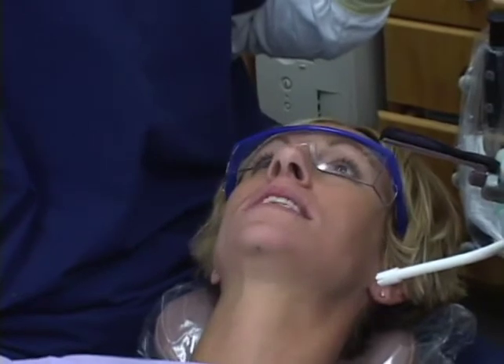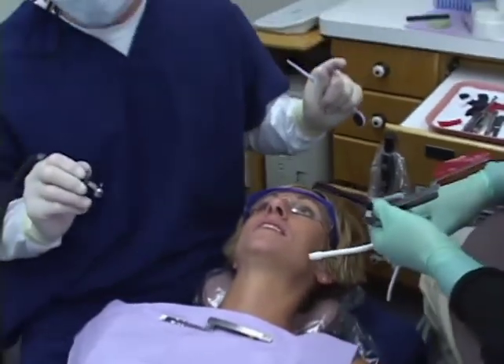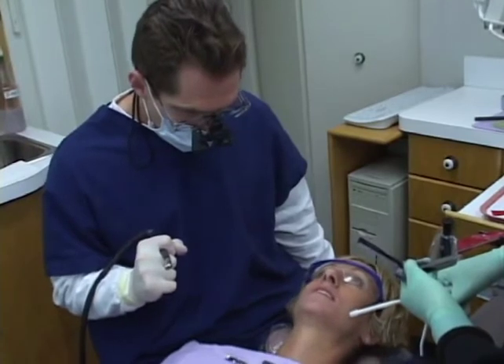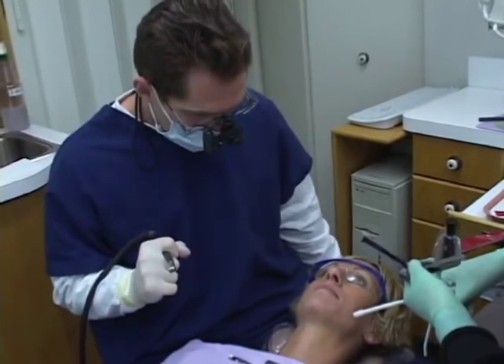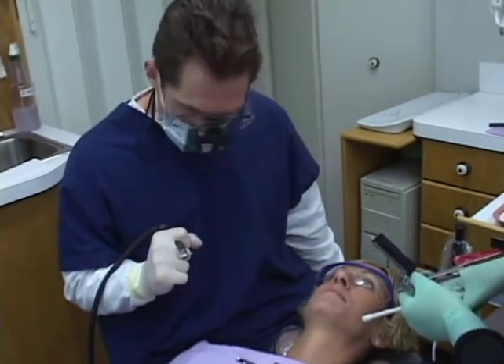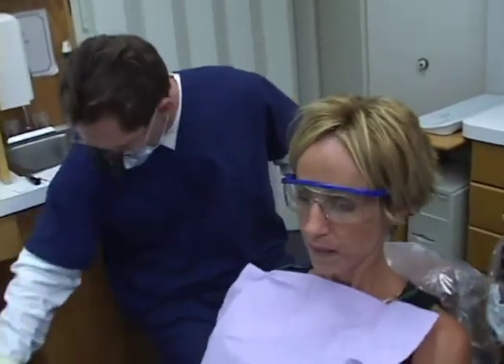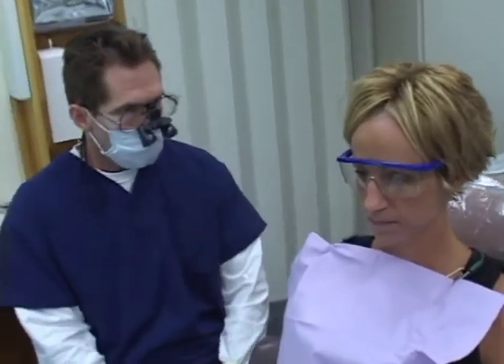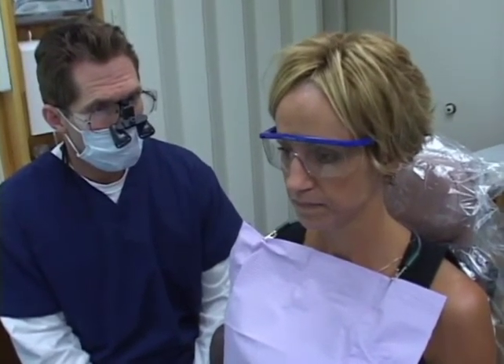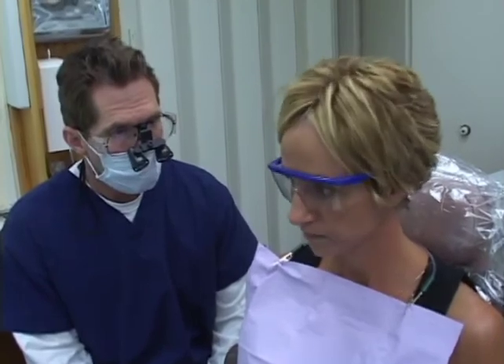Is that it? - That was it. Squeeze real tightly, real firmly. This is a case where, for those familiar with the T-scan, it's really nice - it's a very expensive piece of instrumentation. I don't utilize it, but for these little fine-tunings it would be nice. Any awareness of anything at all? - No. Grind your teeth around - any awareness of any teeth, anything in the way? Feels good. No awareness of anything at all. Feels very even. Very nice.